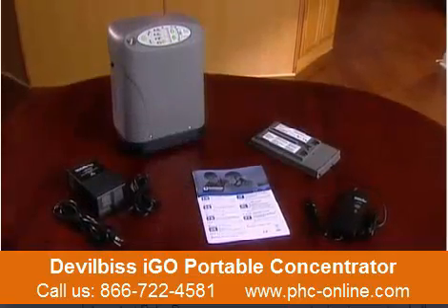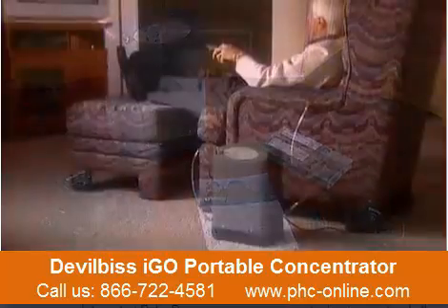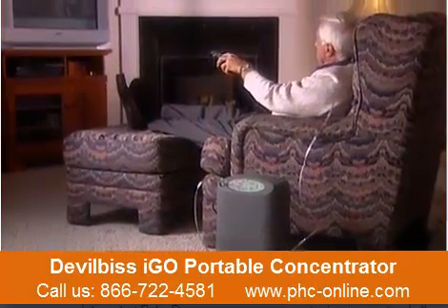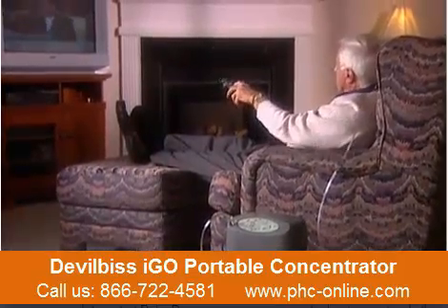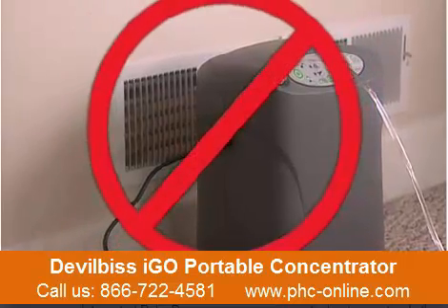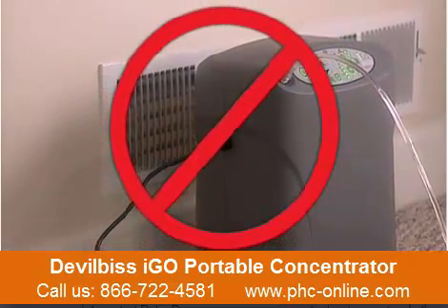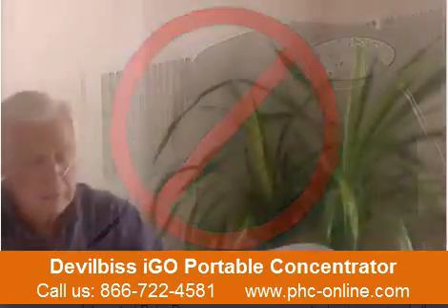Before using your iGo system, make sure you follow these important safety precautions. Always keep your iGo system at least 5 feet from hot sparking objects or any open source of flame. In addition, do not locate your iGo system near flammable materials or in the direct path of any heat source, such as a heat register or car heater.